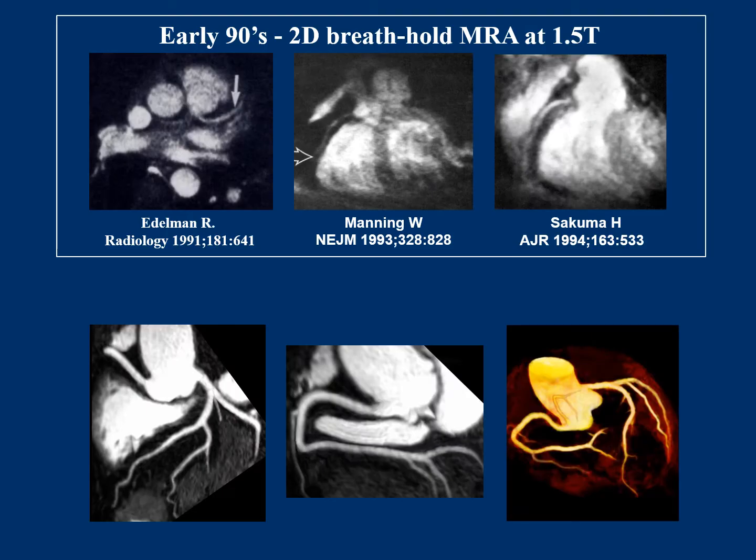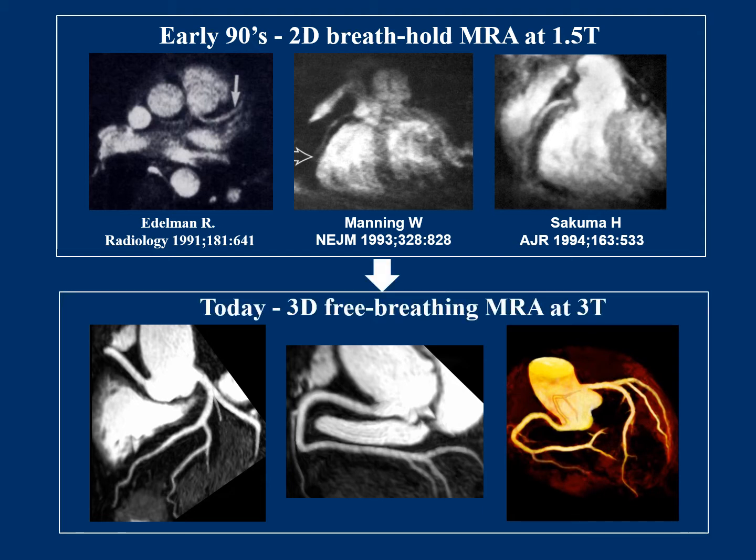Coronary MRA has a history of over 20 years. In the early 90s, coronary MRA was acquired with a 2D gradient echo approach. Today, image quality and diagnostic performance of coronary MRA are improved.